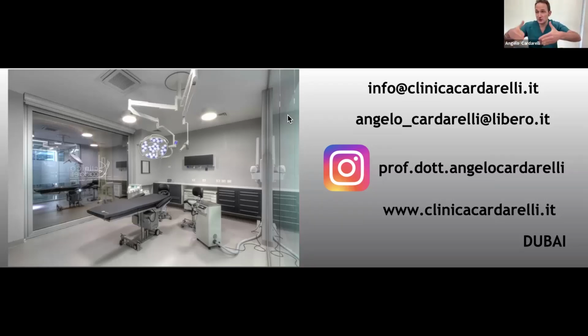The implants are on the palatal side. So if you see the OPG, you can see the implant in the nasal area. Why? Because this is an overlap, they are at two different levels. So in the OPG this is the overlap, but the implant is not in the nasal cavity.